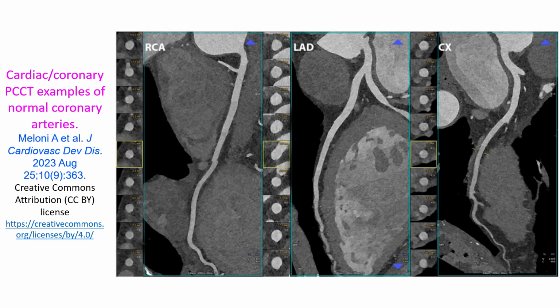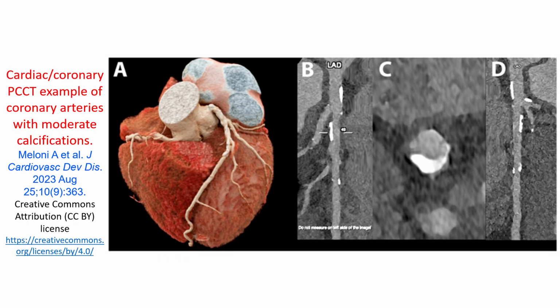Elimination of septa between detector elements significantly improves spatial resolution and radiation dose efficiency. Electronic noise is also eliminated to a large extent by photon-counting CT compared to conventional CT technology, leading to clearer images. Still important are the blooming artifacts on coronary CT angiography in those with coronary stents or severe calcification. Blooming artifacts can lead to overestimation of stenosis and a false positive result.